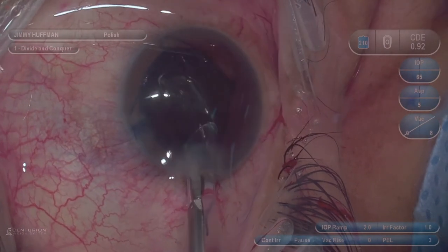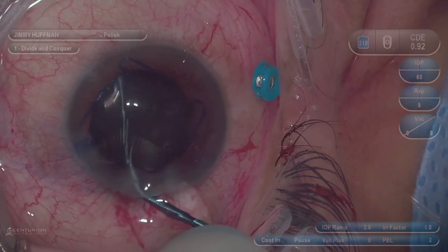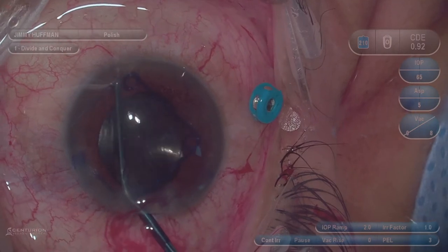Here we are doing a FACO with the Centurion, and you can see on the heads-up display all your parameters, which is really great. We used an iris ring, a Malyugan ring, on this patient.